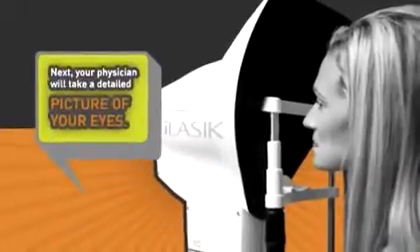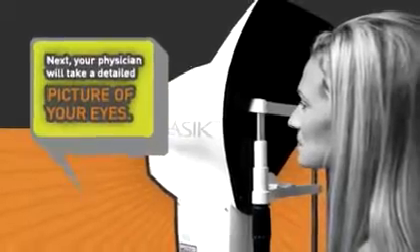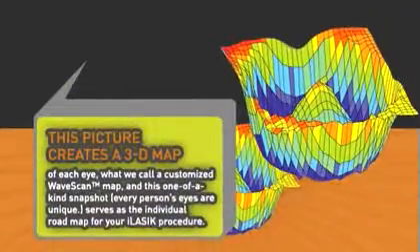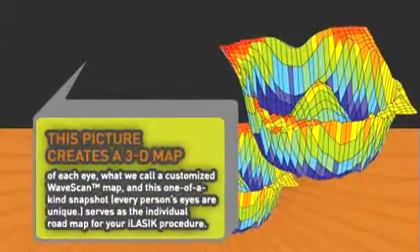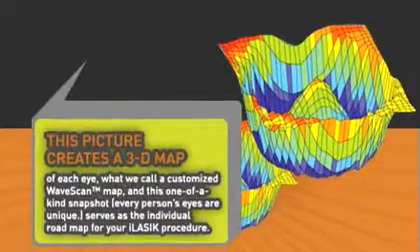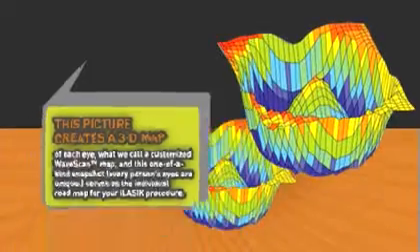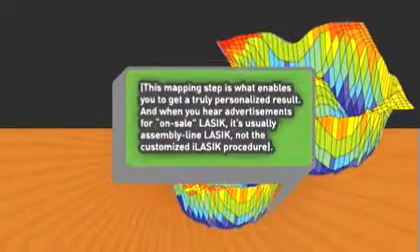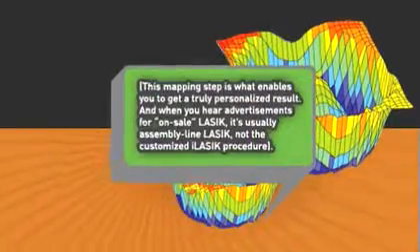Next, your physician will take a detailed picture of your eyes. This picture creates a 3D map of each eye, what we call a customized wave scan. And this one-of-a-kind snapshot serves as the individual roadmap for your iLASIK procedure. This mapping step is what enables you to get a truly personalized result.